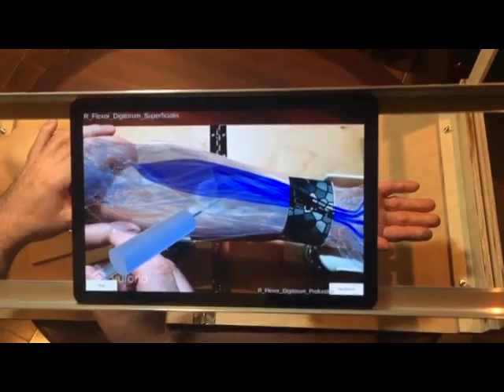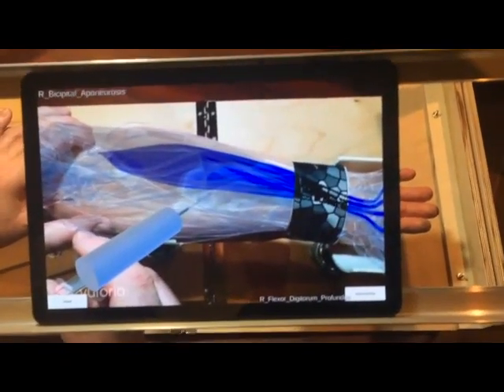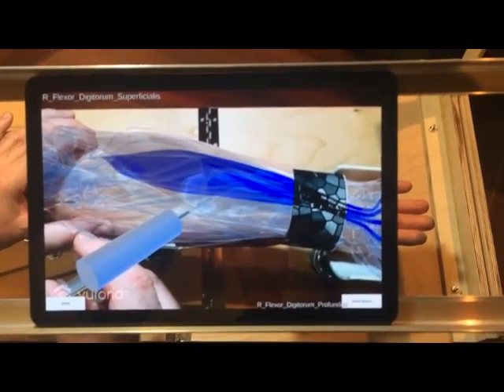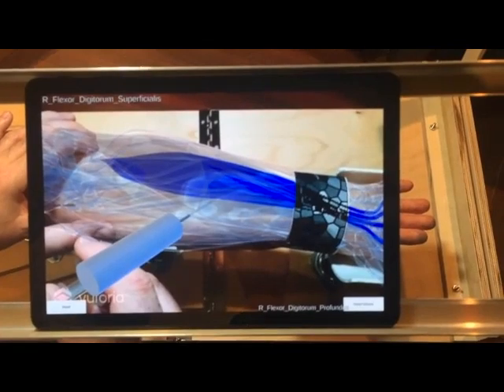The target muscle will turn blue from the usual color when the needle track is correct for injection success and will turn green when it's inserted.